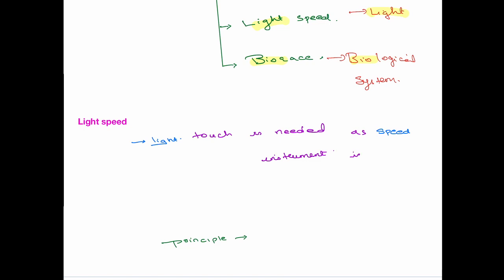When we come to the other systems, the speed is much lower. Here it's 1500 to 2000 rpm. If you have ever done rotary endodontics, you'll see it is much higher, and due to this high speed, a light touch with the canal was needed. That's why it's called the Light Speed instrument.